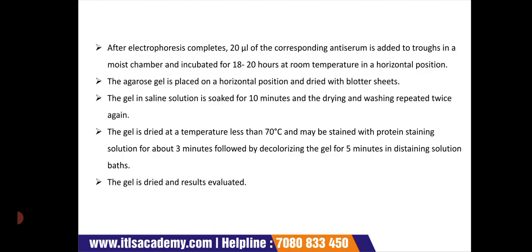Then the agarose gel is dried with blotter sheet; you take the blotter sheet and dry the agarose gel placed in a horizontal position.